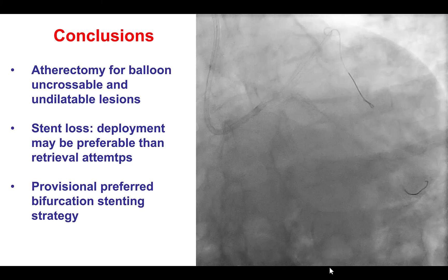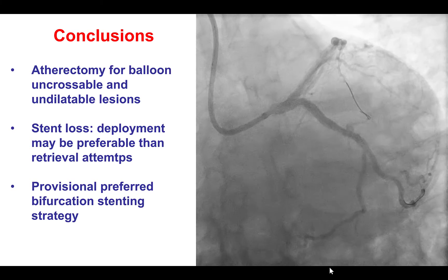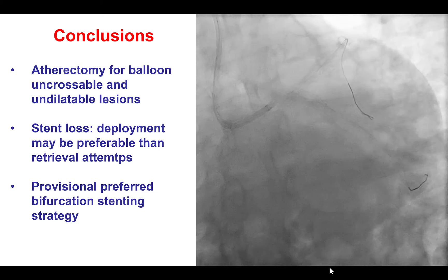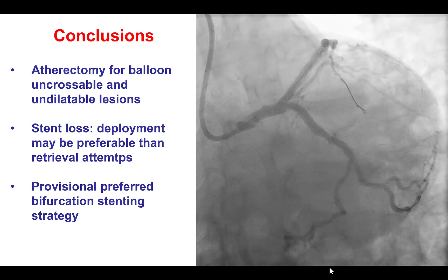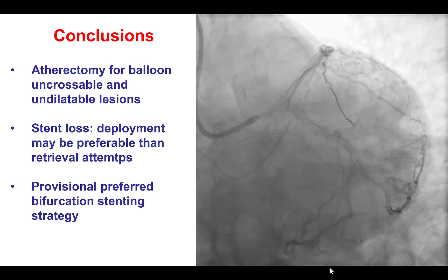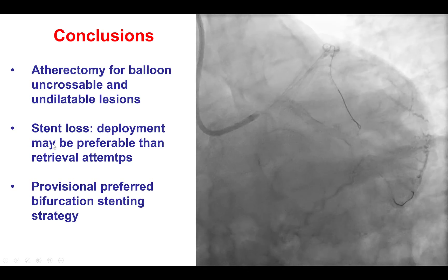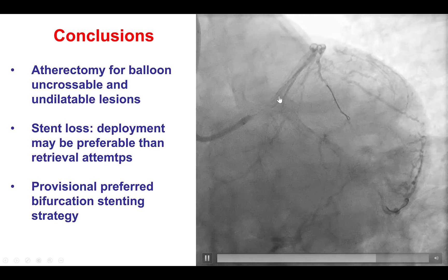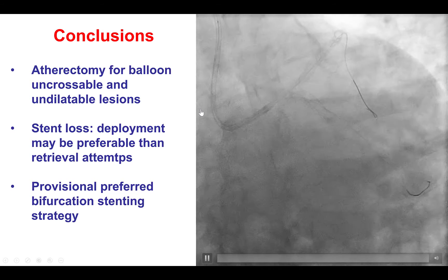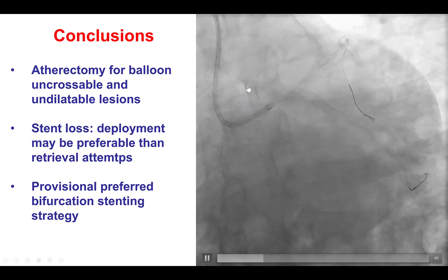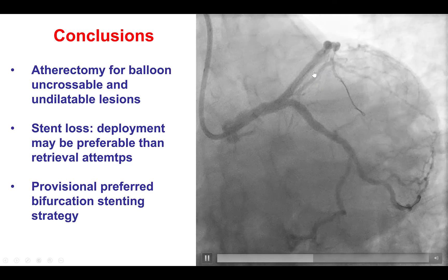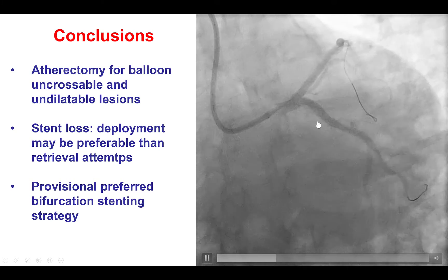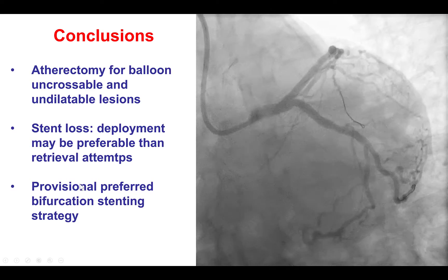In summary, this is an example of a patient with complex multivessel coronary artery disease. Because of diabetes, surgery would have been the preferred approach, but the patient declined. We tried to dilate the lesions, but the circumflex was balloon-undilatable and the LAD was balloon-uncrossable, which is why we performed orbital atherectomy to enable equipment delivery and stent expansion. We did unfortunately experience stent loss in the LAD — retrieval with a small balloon failed, and we ultimately deployed the stent inside the previously placed stent. Deploying or crushing the stent is sometimes safer than aggressive retrieval, as the latter may lead to complications. Finally, the provisional strategy worked well for both the LAD-diagonal bifurcation and the proximal circumflex lesion.